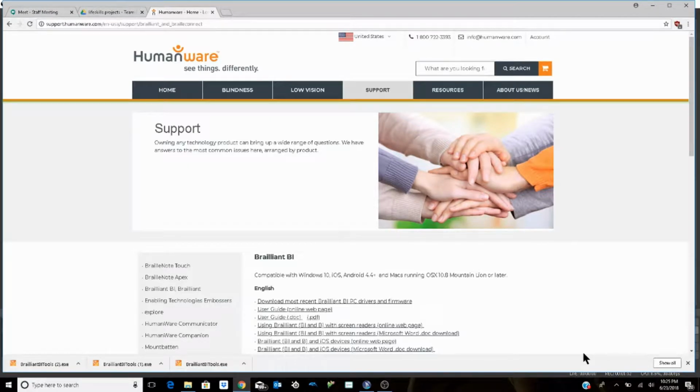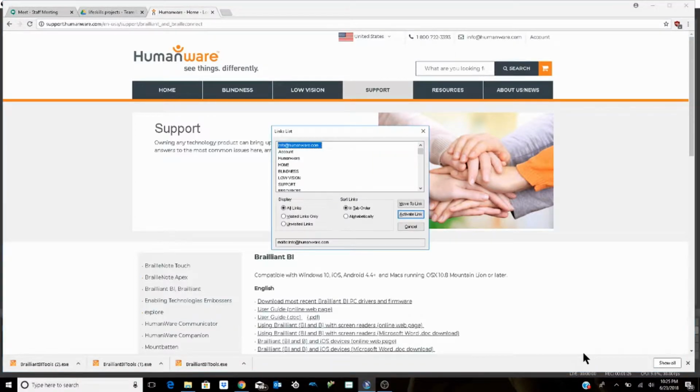And then I'm going to do a links list. Oh, first, let me turn my numpad off. Numlock off. F8. Oh, Links list dialog. There we go. So to do a links list, for those who don't know, it's insert F7 or JAWS modifier key F7, because it can be insert or caps lock depending on if you're using desktop or laptop mode.